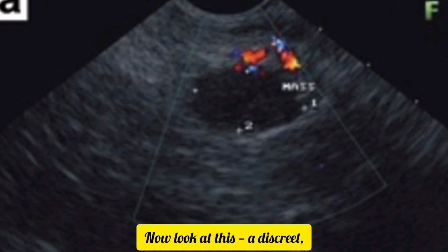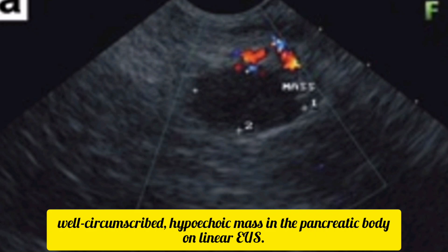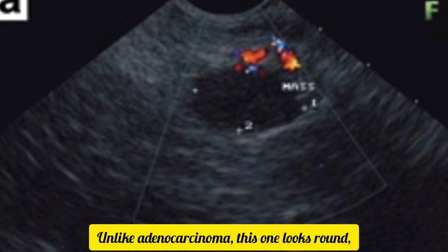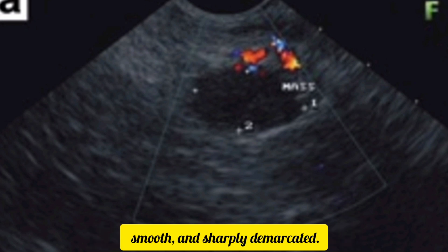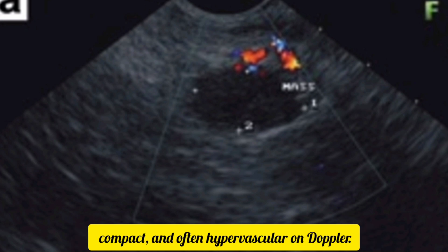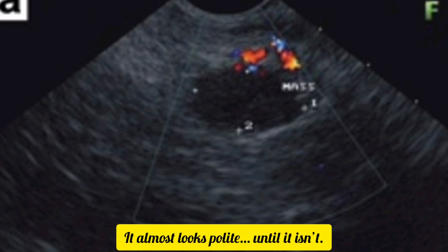Now look at this, a discrete, well-circumscribed, hypoechoic mass in the pancreatic body on linear EUS. Unlike adenocarcinoma, this one looks round, smooth, and sharply demarcated. It's the personality of a neuroendocrine tumor. Neat, compact, and often hypervascular on Doppler. It almost looks polite until it isn't.